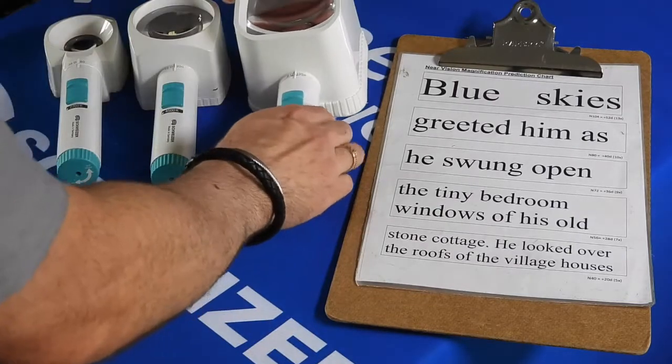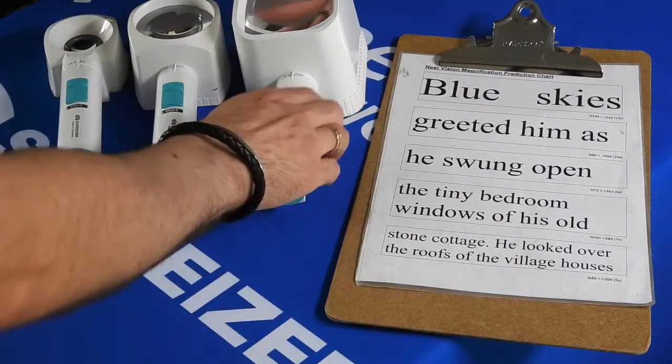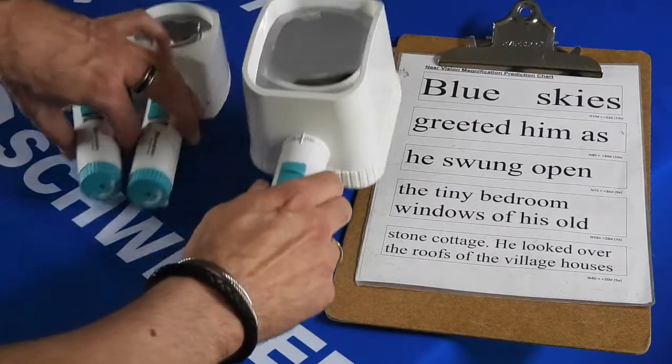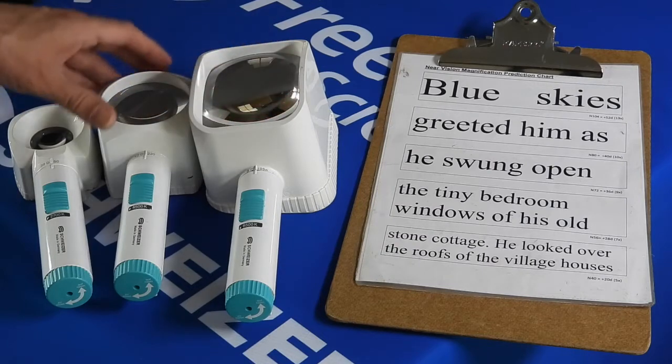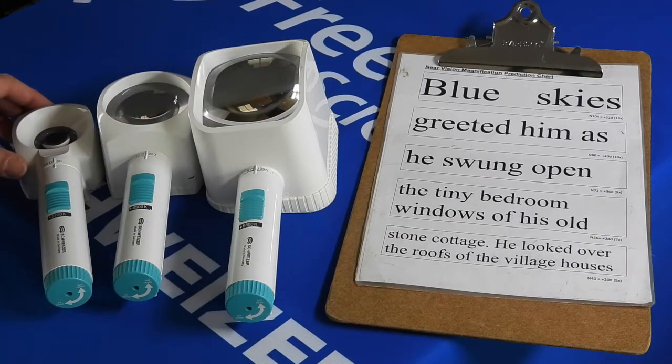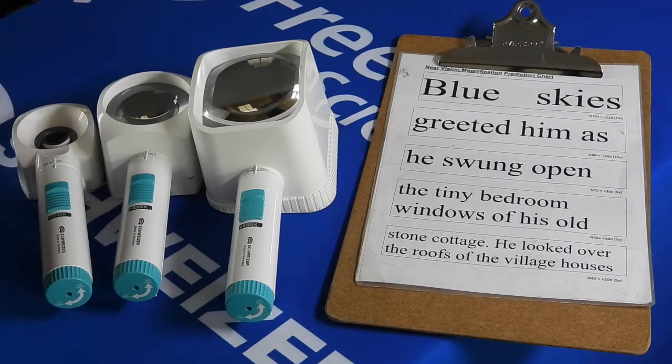This comes in various powers, so you'll see the three magnifiers on display. One has a very large optical lens, one medium, and one smaller. Like our hand magnifiers from the hand magnifier video, it is very important to get the correct working distance from your reading material.